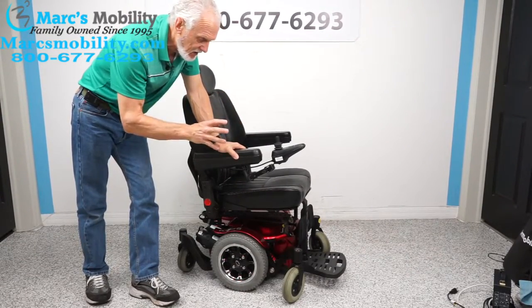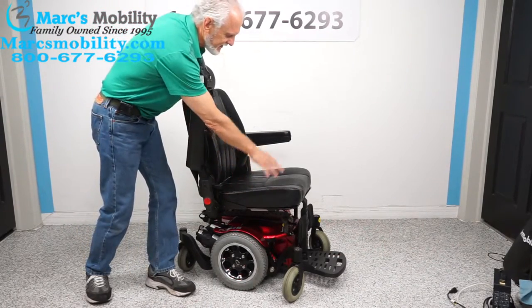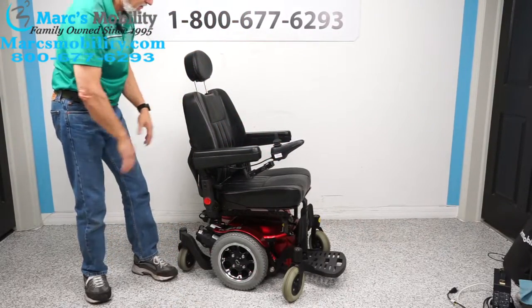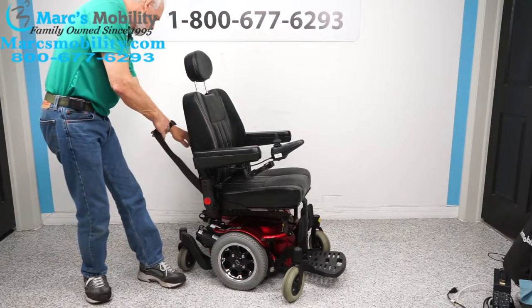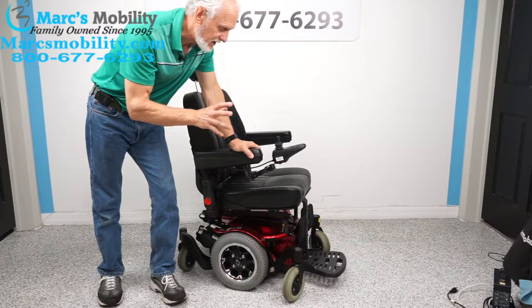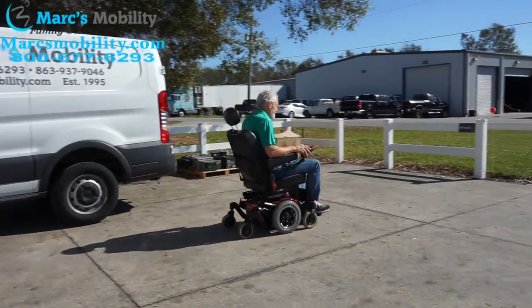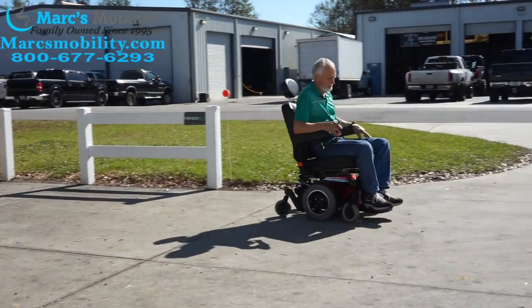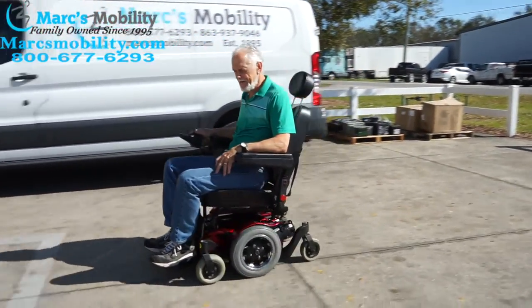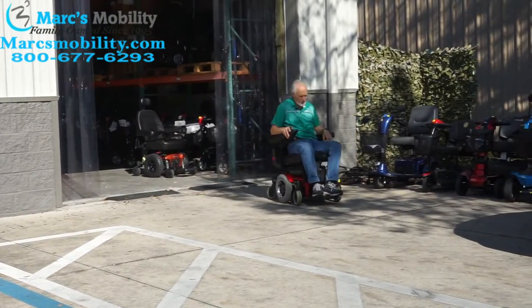It's very quick and compact with solid tires all the way around, a flip-up foot plate, captain seat of 19 by 19, swing-away joystick, adjustable headrest, and a safety belt. It comes with a charger. Watch the video and you'll see what I mean when I drive this chair — it's really quick.